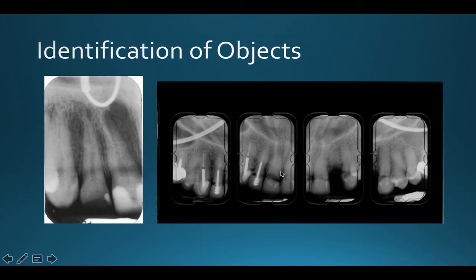And lastly, it's important to be able to identify when we've made a little mistake. Sometimes on your radiographs, you're going to find that you left in some jewelry, or you left on a patient's glasses. Again, we want to make sure that we're removing anything that might interfere with the radiographs ahead of time, but it's good to be aware of what they are. So here the patient left in their nose ring, and down here, that patient left on their glasses. That is not an anatomical finding. That is the patient's glasses.